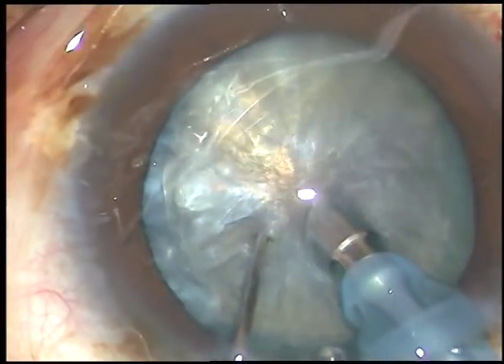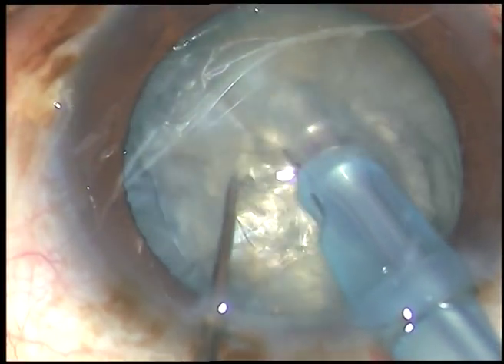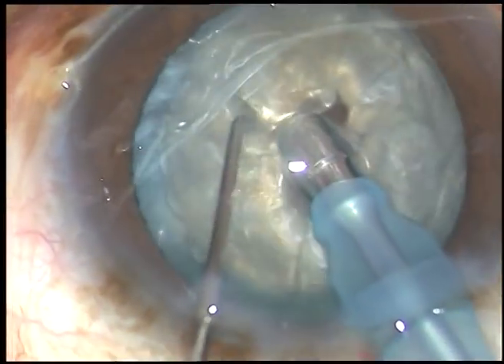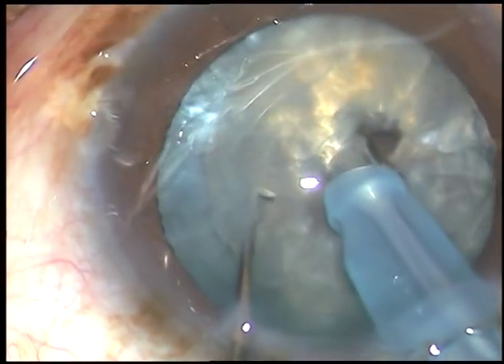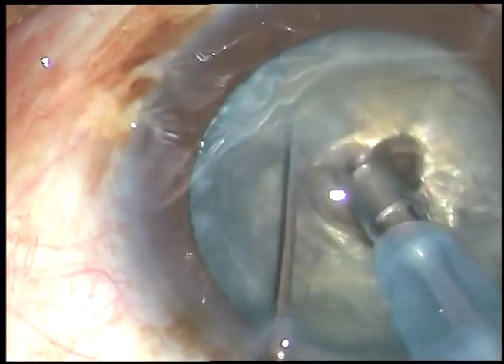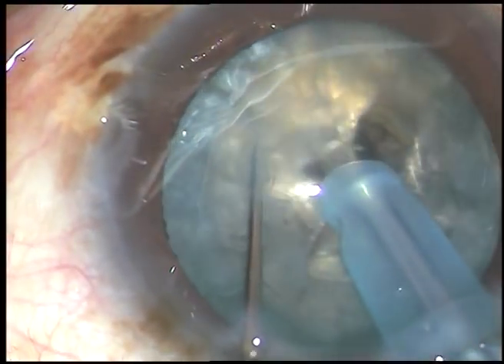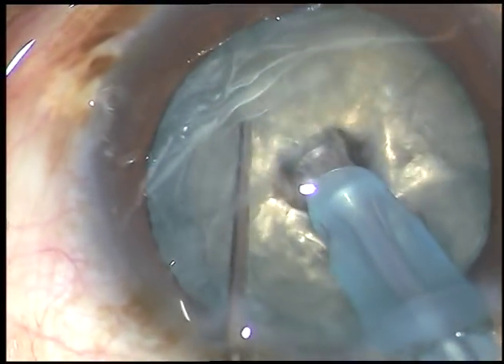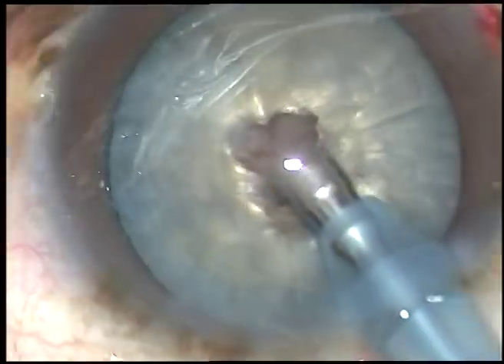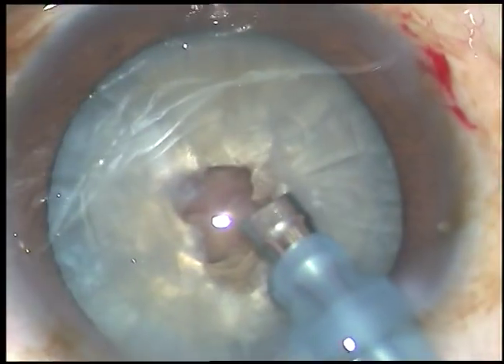What I am going to do is weaken the central hard core of the nucleus — it is like making several punches on the bosom of this cataract. Some sculpting in bevel-down position of the phaco tip. Now I turn the tip and make it bevel-up.